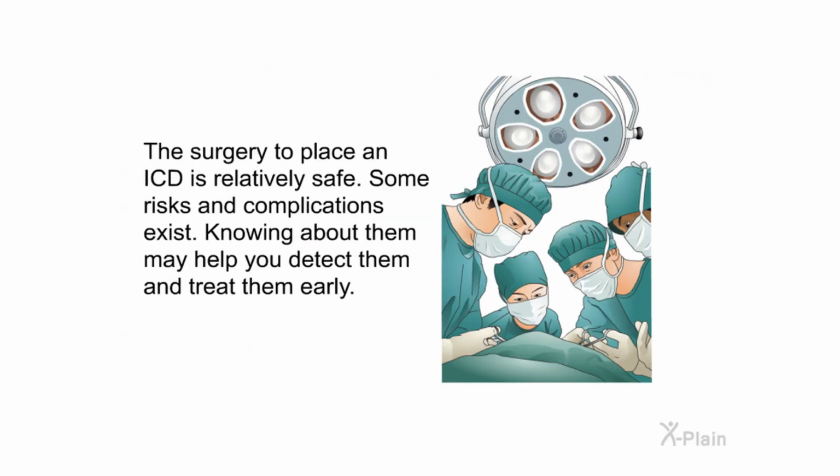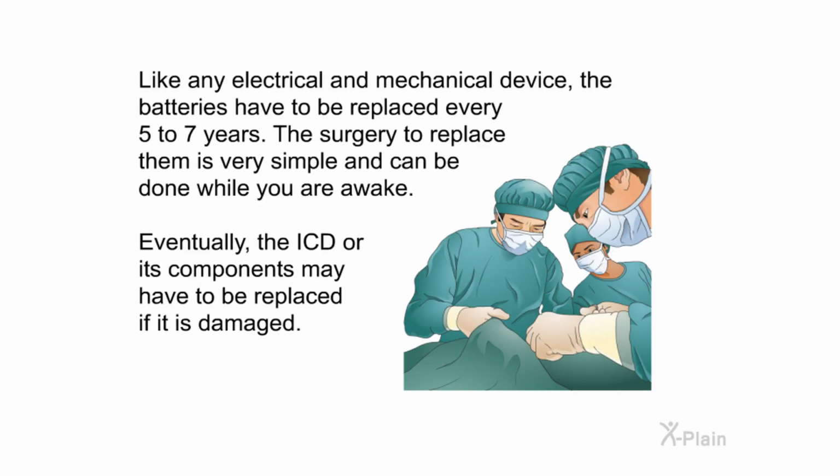The surgery to place an ICD is relatively safe. Some risks and complications exist. Knowing about them may help you detect them and treat them early. Like any electrical and mechanical device, the batteries have to be replaced every 5 to 7 years. The surgery to replace them is very simple and can be done while you are awake. Eventually, the ICD or its components may have to be replaced if it is damaged.